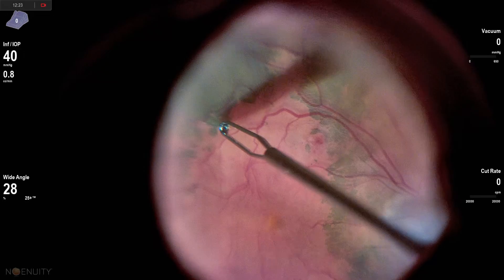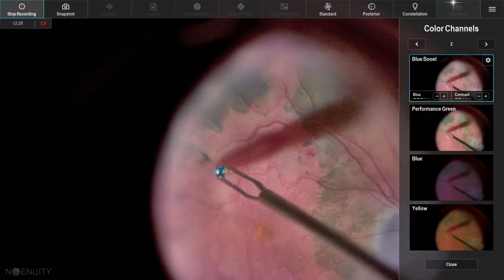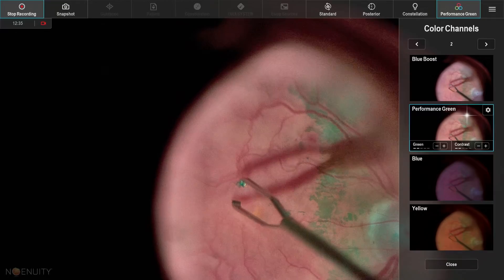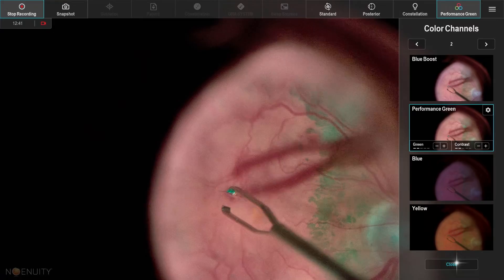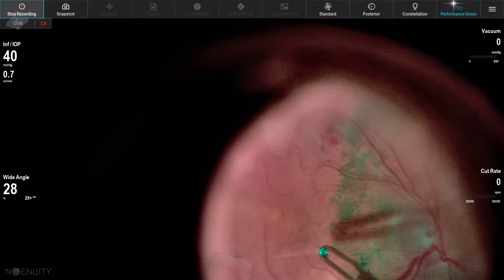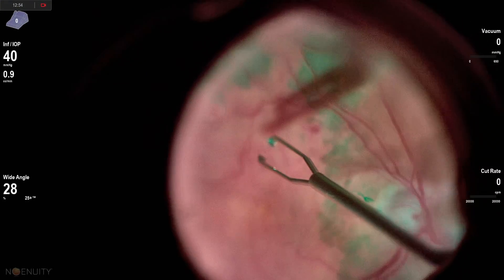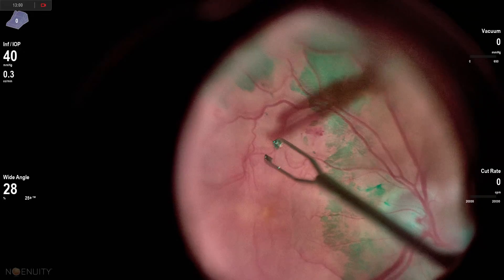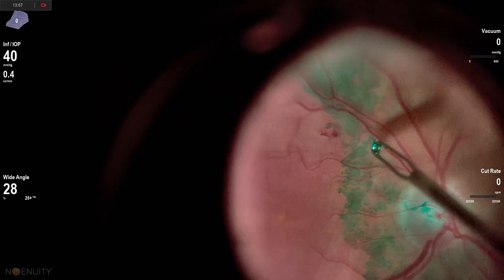I try to start at the junction of the ILM and epiretinal membrane where you have staining and no staining. I didn't like my first grab along the inferior temporal arcade, but here I get a nice healthy purchase of the epiretinal membrane. I changed the color contrast a bit — I found it was a little distracting in this case. I'm able to grab the epiretinal membrane and after a couple of grabs it comes up really nicely. This epiretinal membrane is translucent, so you have to have some memory of where it ends up so you can go back and grab it and start peeling from the edge.